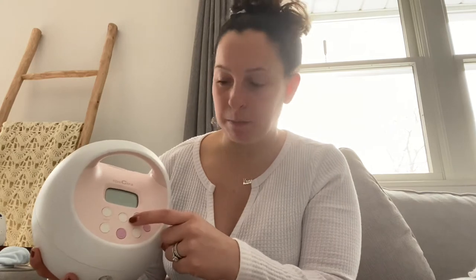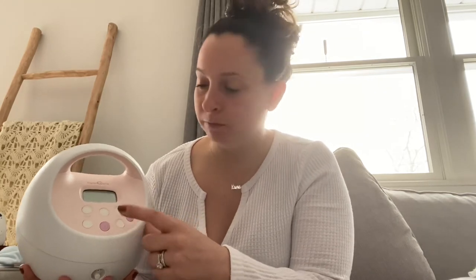This button with the waves on it is how you change from expression mode to stimulation mode — just two settings, very simple once you get the hang of it. On the left is cycle and on the right is your vacuum, up and down.